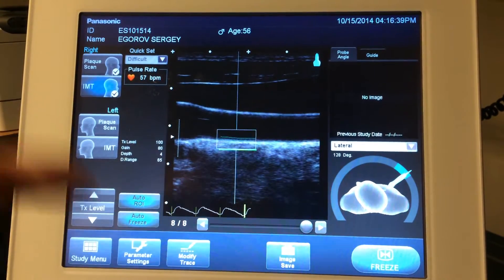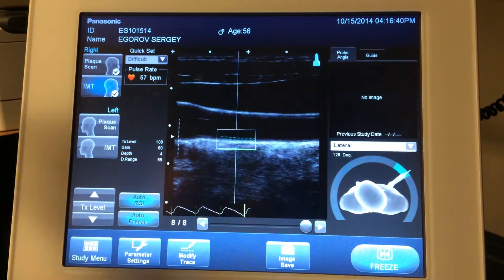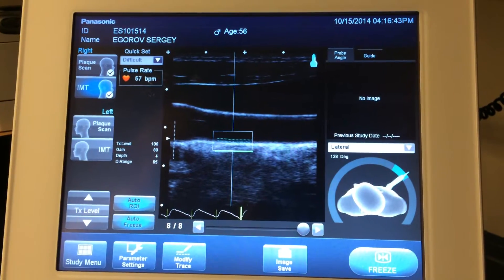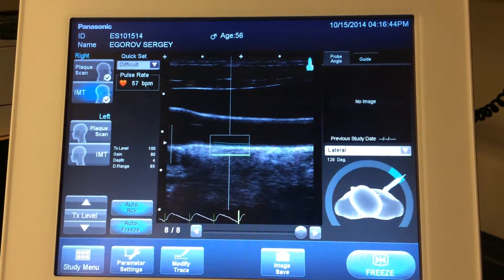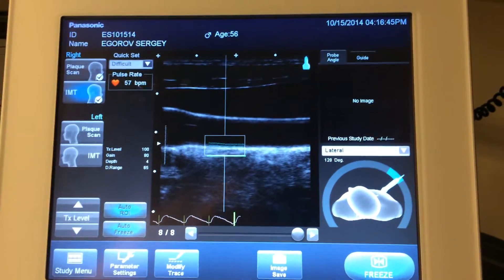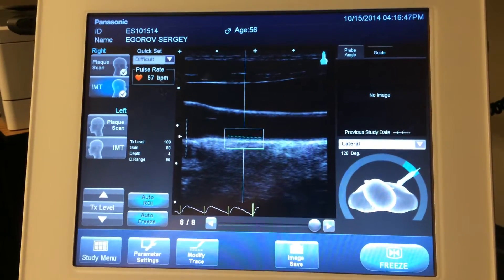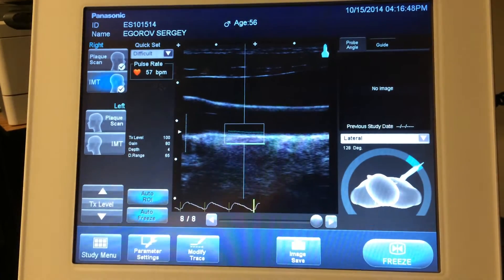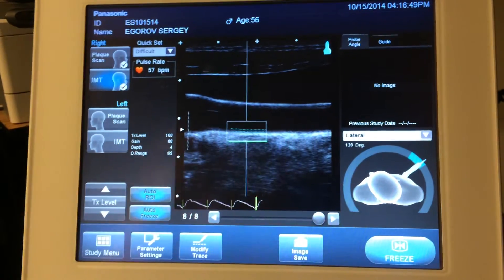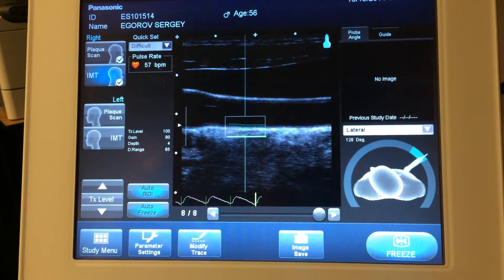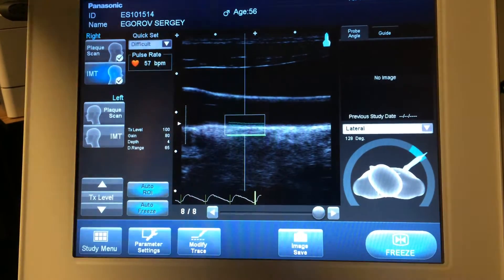So now I'm going to have to do the other side, but it's exactly the same thing. So whatever I said on this side also applies to the other side. You're going to have to turn your head the other way. You probably won't be able to get as good a picture, but it's the same thing pretty much.